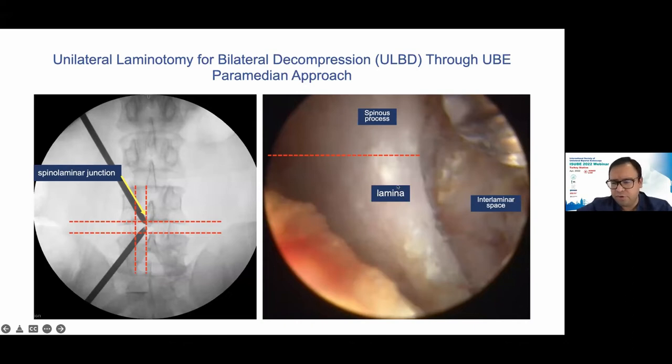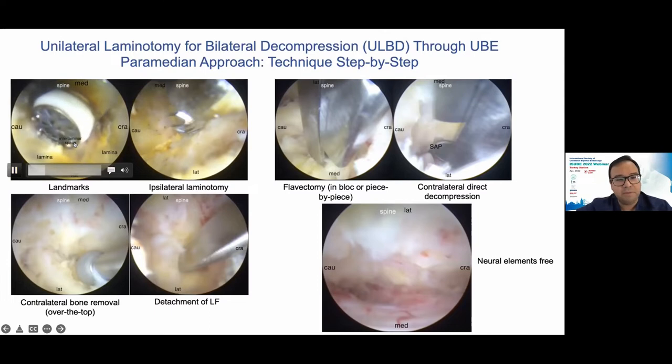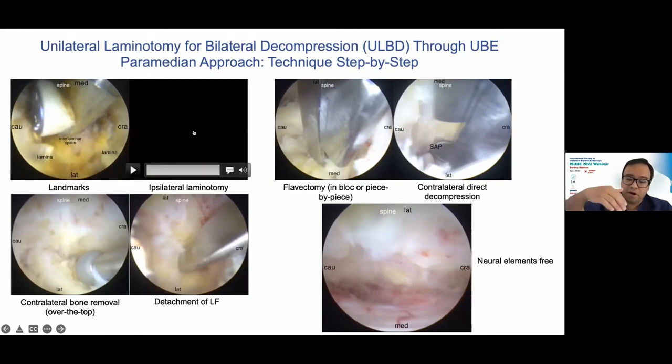In this figure, you can observe the lamina and spinous process and the interlaminar space. This is a very usual picture that the surgeon that performs UBE recognizes in every procedure with a paramedian approach. Then to complete the decompression, you have to create your working space and clean your bone landmarks. In this case, you can observe the interlaminar space. After that, you can start with your bone decompression, performing the undercutting of the lamina, the ipsilateral laminotomy.